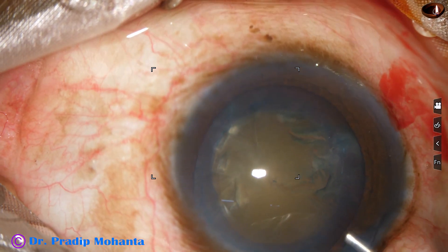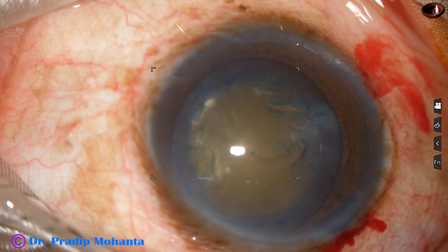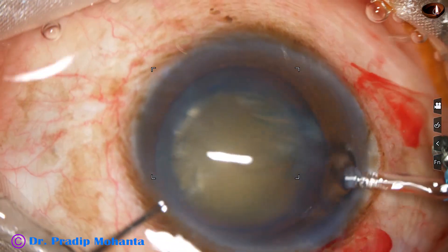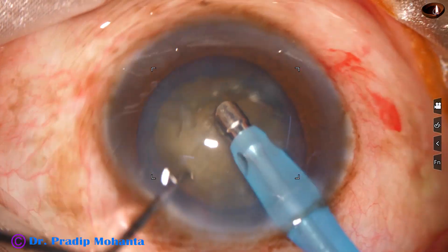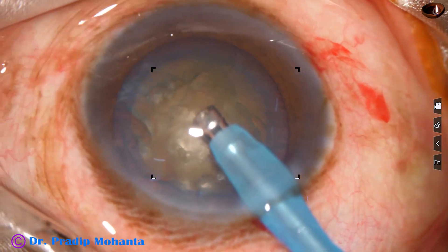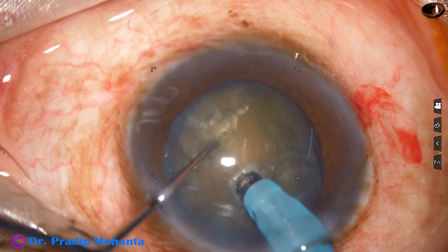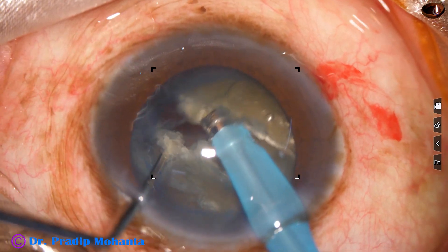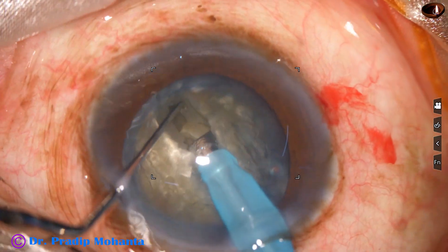Viscoelastic substance is injected after hydrodissection. And now it's time to divide this nucleus into some pieces. Some superficial cortical lens matter is removed. The handpiece is turned to make the bevel up towards the cornea. The nucleus is pushed a little down, the tip is buried into the substance of the nucleus, and it goes through the nucleus towards the opposite equator. As it reaches near the opposite equator, the chopper is used to crack the nucleus into two hemi nuclei.